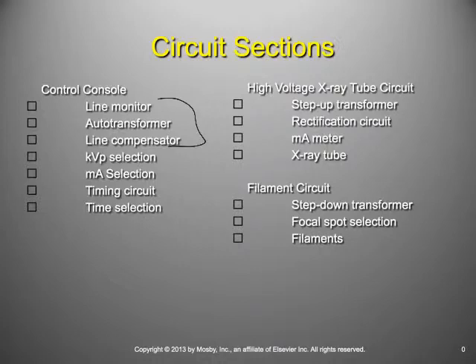Okay? Then we're going to have the ability to select a kVp and a time and an mA, right? So those are just selection dials, and we can go into that X-ray room. I can show you how those selection dials work, but it's just like, I don't know, selecting a volume on the stereo or something like that.